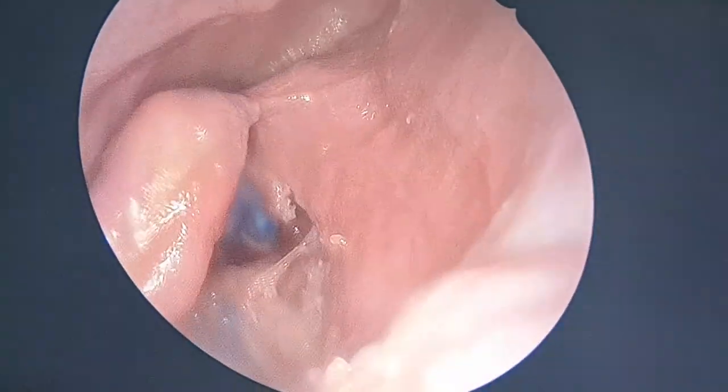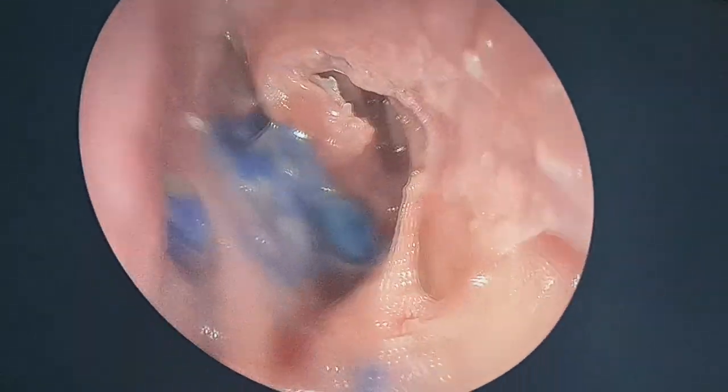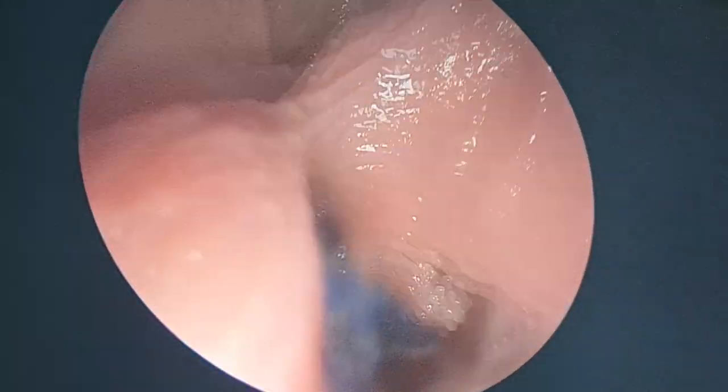Now, I will change to an angled endoscope here, 45 degree. Generally, in my practice, I use 70 degree for added advantages. But yes, 45 will do as well. See now. I mentioned again and again during the radiology part.